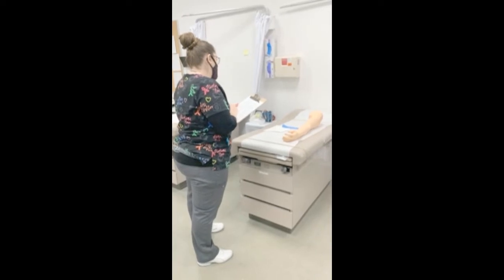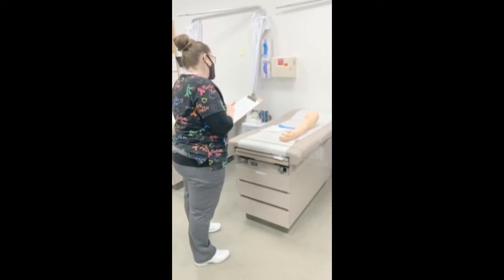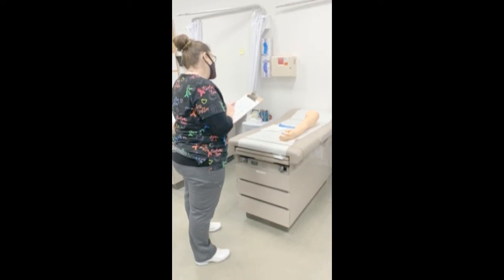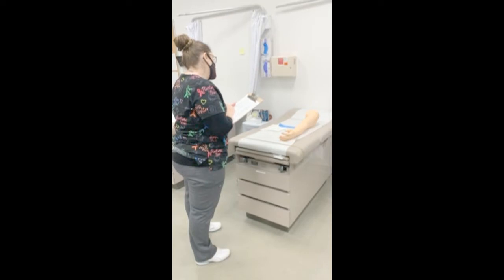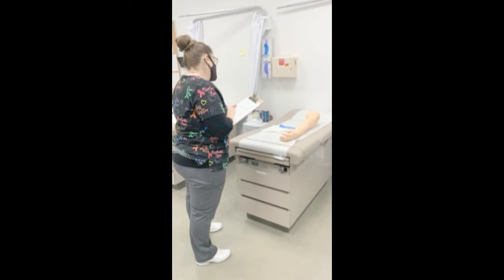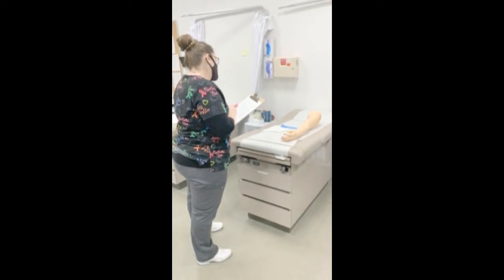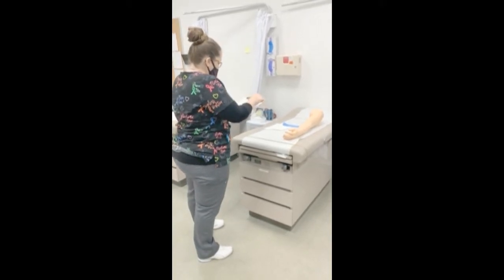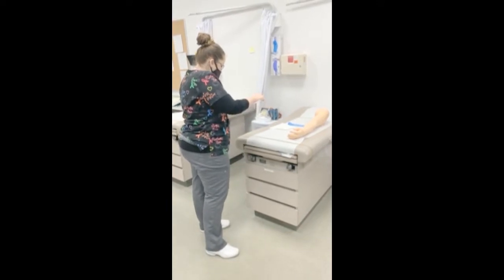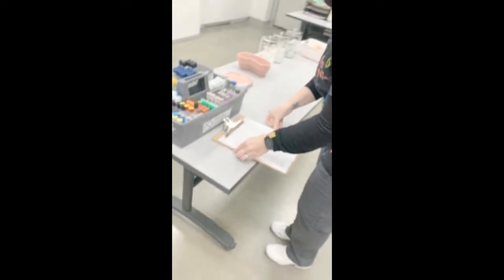This is one of my favorite questions. The patient is going to give you one of two answers. The first answer they're gonna say is, oh, you have to go right here — this is the only spot they've ever been able to get me at, which is very limiting. Otherwise, they're gonna say you can go in any arm you want to — that's the best answer. That means you can apply the tourniquet and palpate any arm at any vein, and it is up to you to use your best skill to find the right vein. These answers also help you determine whether the patient has had good or bad experiences having their blood drawn in the past.